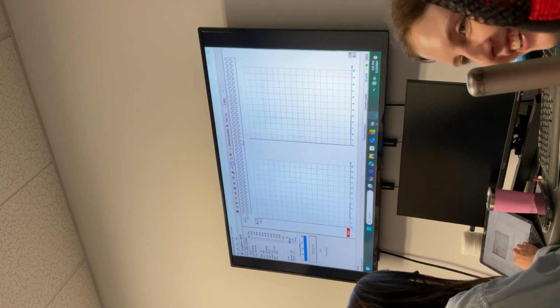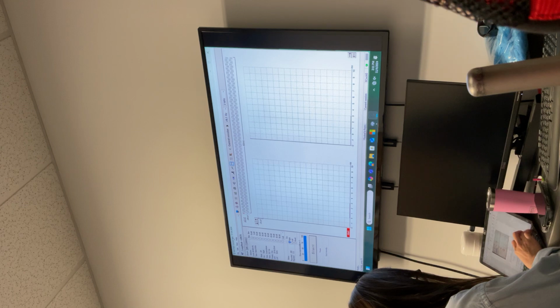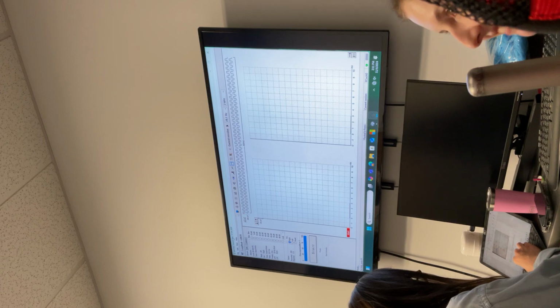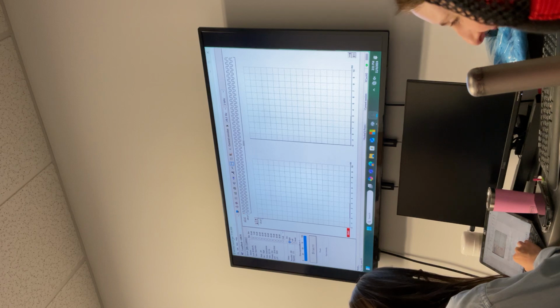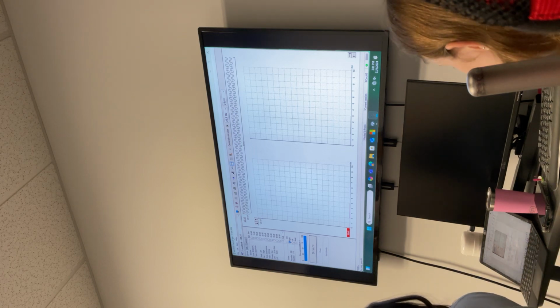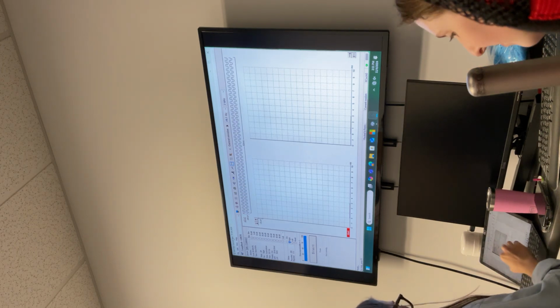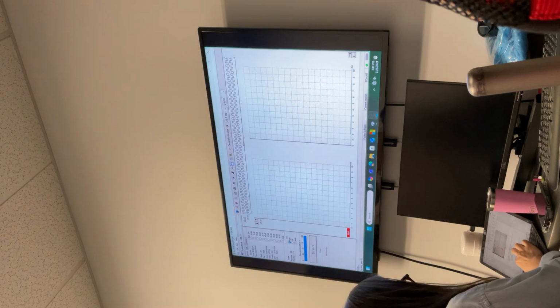But if there's not a big response, then you have to go up, because you have to be confident. With a chirp, you'll be really confident in your response, the amplitudes are big. It depends on the signal to noise ratio and what else? Residual noise. If the noise is large, then you have to average more.